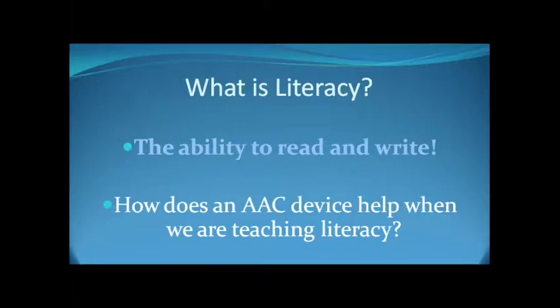How many apps are there for the iPad? There's just the one, Touch Chat. Oh yeah, the Touch Chat HD would be for the bigger ones, but actually I think they're all kind of the same. There's not really that little tiny phone thing anymore, right? Or yeah, you can put the HD on your phone now. And if you get the Touch Chat app, and as long as you're using the same iTunes, you can put it on, like if mom has a phone to put it on, and then the student has a device, right, you can do that.